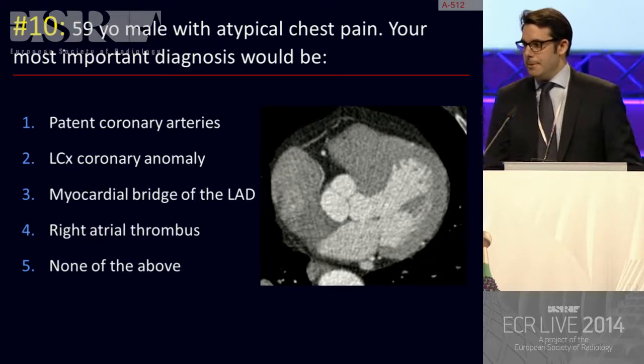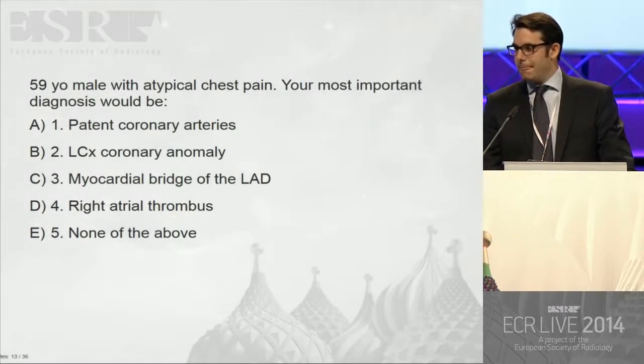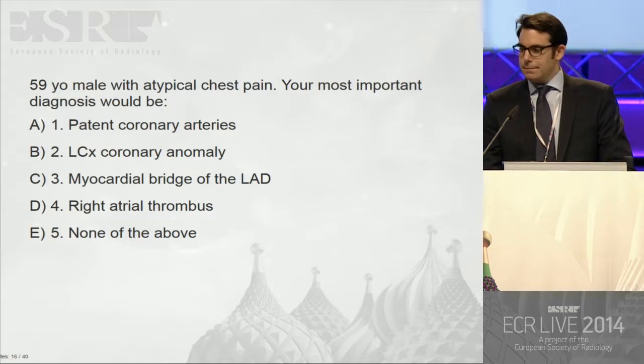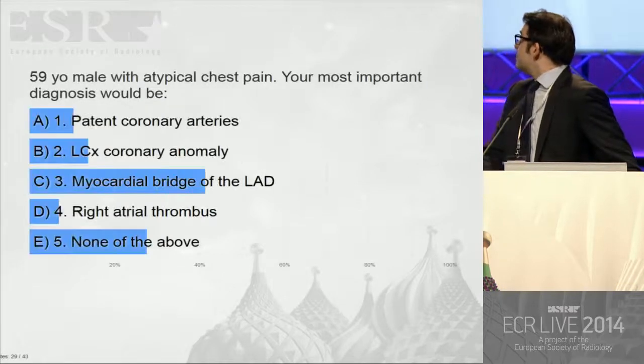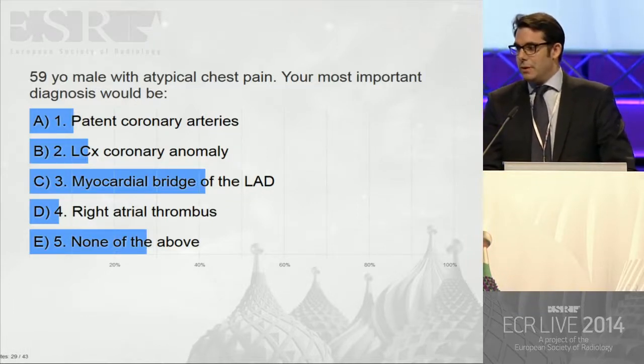You can vote, please. Myocardial bridging of the LAD, and the rest said none of the above.